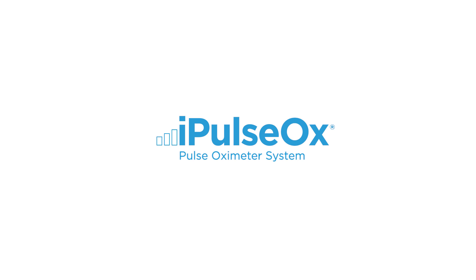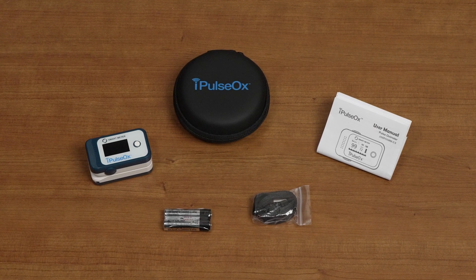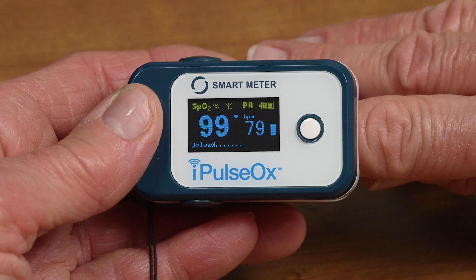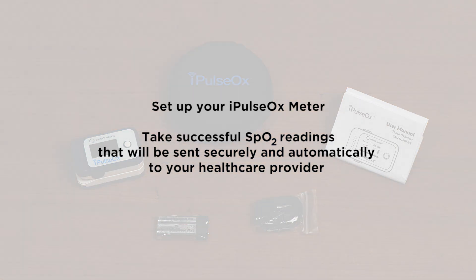Welcome to this instructional video for the I-Pulse Ox Monitor. The I-Pulse Ox Monitor is a cellular-connected pulse oximeter to help make managing respiratory disease simpler. The I-Pulse Ox measures SpO2, or oxygen saturation levels, as well as pulse rate. In this video, we will cover a number of topics that will help you set up your I-Pulse Ox Meter and take successful SpO2 readings that will be sent securely and automatically to your healthcare provider.